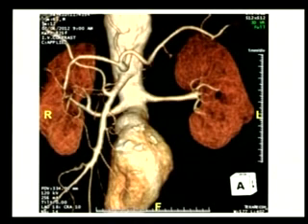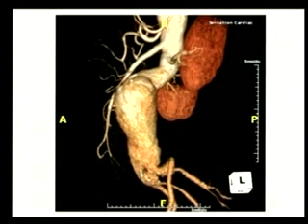Yeah, this is a close-up of the neck from almost anterior view. The right renal is a little lower than the left, so we'll have to start our device from the right renal. Next slide, please. This is the lateral view, and you can see that there is a lot of angulation in the neck. It's a conical neck which is flaring out as it goes down, and there are 2 right angle bends there. So we'll have to look at this neck from a cranial angulation to open it out while deploying the device, which is what we're going to do.